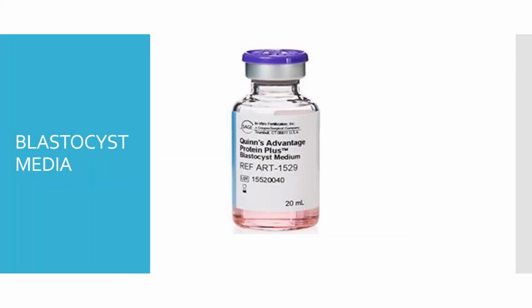Blastocyst media. Blastocyst medium combines essential and non-essential amino acids, alanyl glutamine, vitamins, and high glucose levels, providing nutritional and physiological needs to developing embryos. Components of blastocyst media are a high concentration of glucose, selected non-essential and essential amino acids, alanyl glutamine, vitamins, increased levels of magnesium, calcium lactate, 10 mg per liter gentamicin, an aminoglycoside antibiotic.